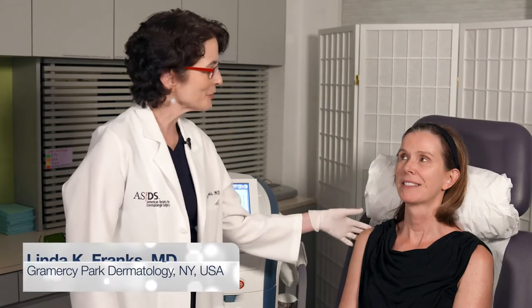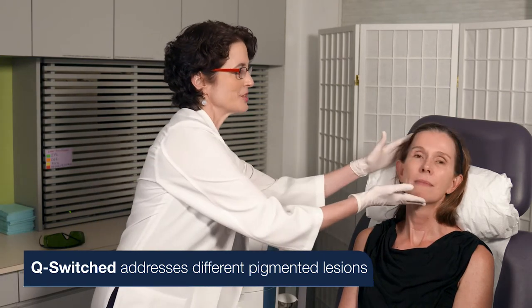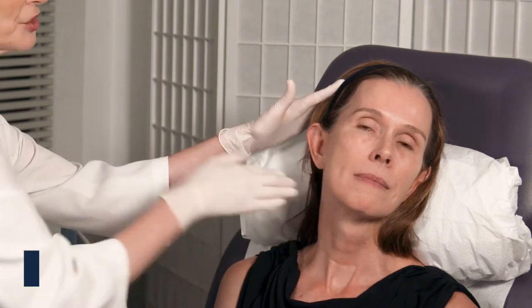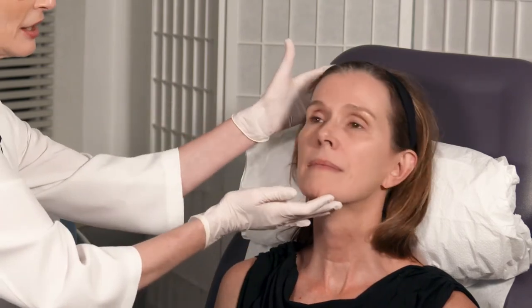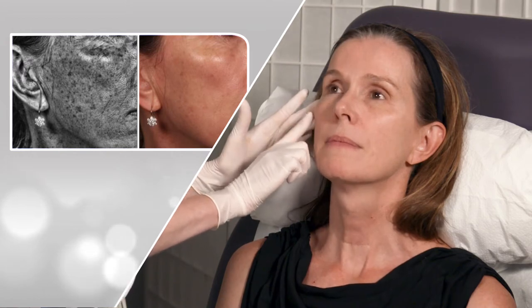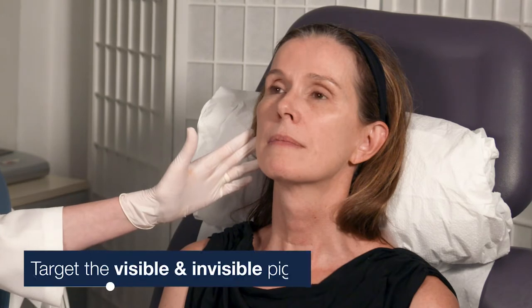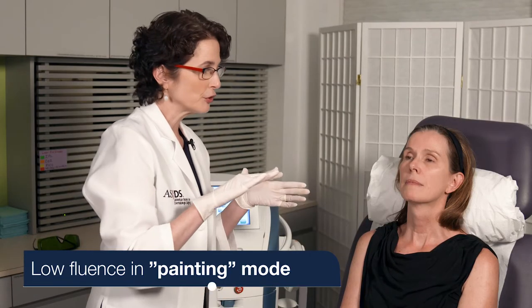We are here with Mimi today — this is her third treatment in a series of monthly treatments. What we're addressing is her background photo damage. You can see some scattered lentiginies, especially where she's had a lot of chronic sun exposure. What you can't see without a Woods lamp or UV accentuation is all the pigment still deeper in her skin. I'm targeting both what I can see and what I can't see, at a low fluence.